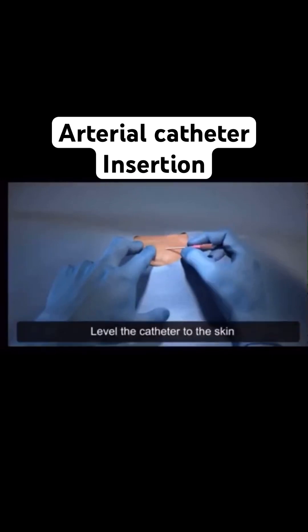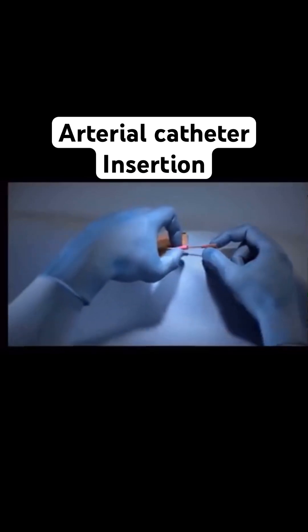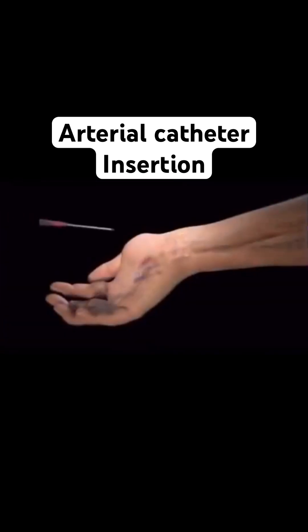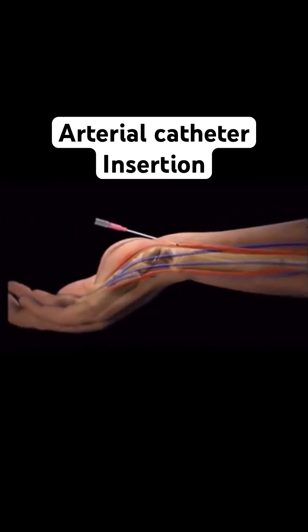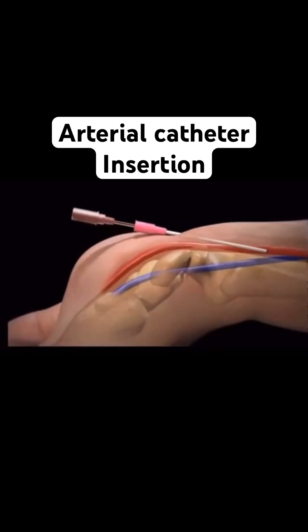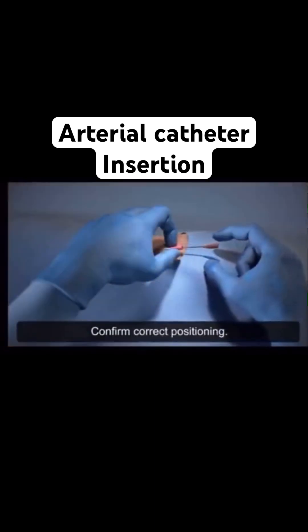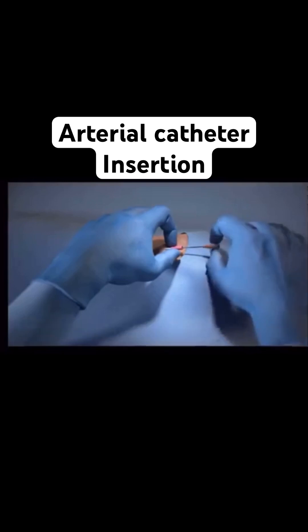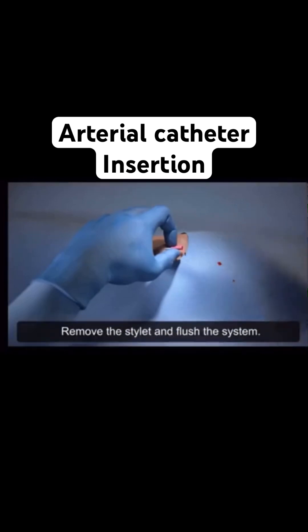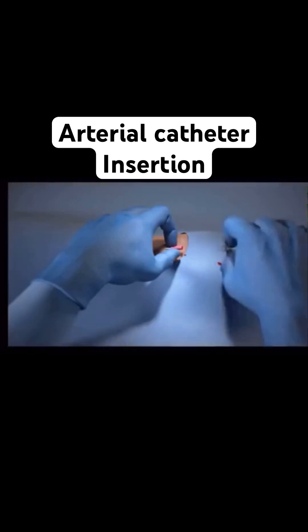Level the catheter to the skin and continue to advance the cannula to its hub. Confirm correct positioning. Remove the stylet and flush the system.